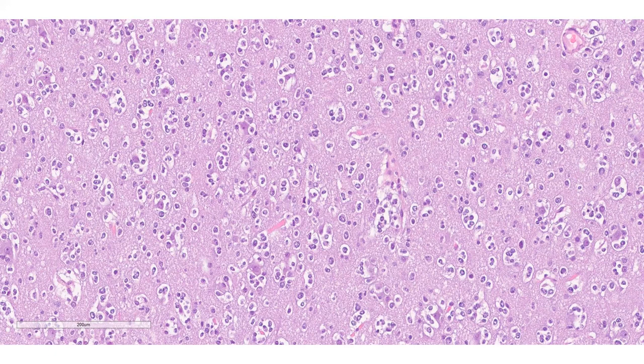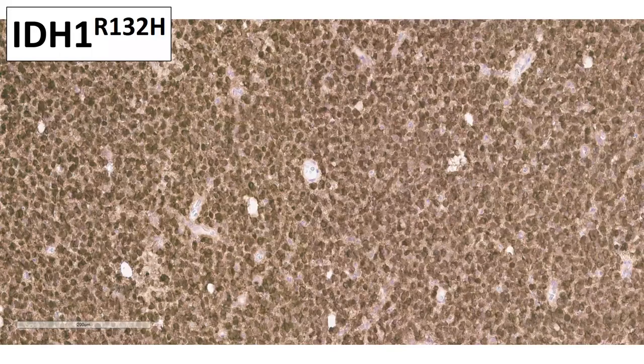All right, that's what H.J. Scherer, who published the paper, The Scherer Structures, called precocious secondary structures. Precocious, meaning that early on, all of the tumor cells infiltrating cortex are surrounding neurons and surrounding vessels with very few cells percolating through the parenchyma. It's a fascinating thing, isn't it? You will see it. It's not very common, I can tell you, but you will see examples. This is getting close.